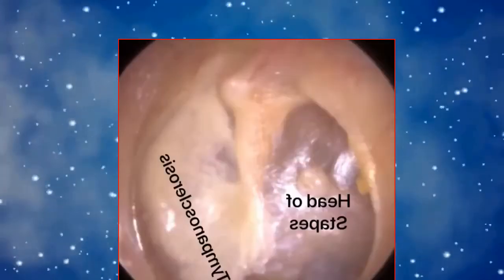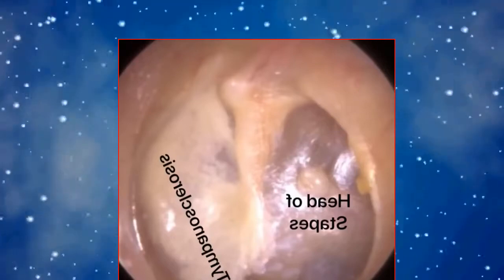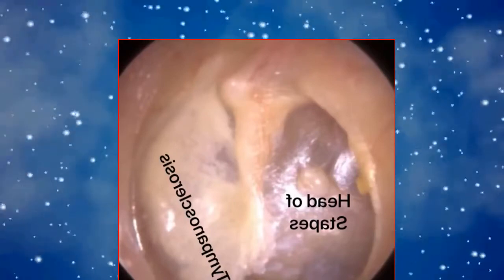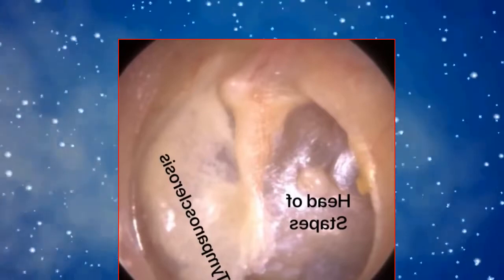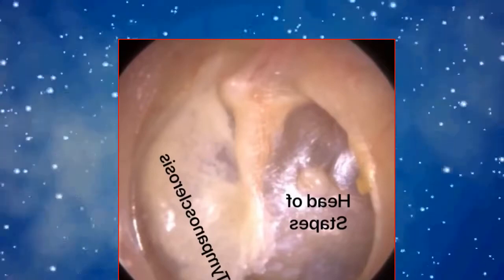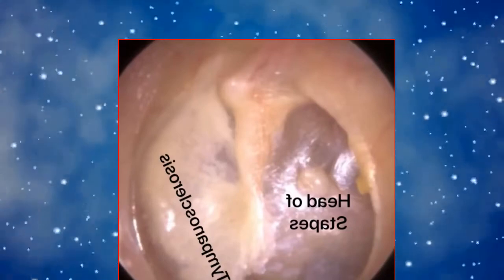So here we are, we've got a still image of the patient's right eardrum. And so to the right-hand side of the eardrum, that's the scar tissue, that's tympanosclerosis. So the patient has a history of chronic ear infections. And sometimes as a part of the healing process, you can get scar tissue. So it's a buildup of calcium deposits, we call it calcification of the eardrum, otherwise known as tympanosclerosis. That's to the right-hand side of the eardrum.